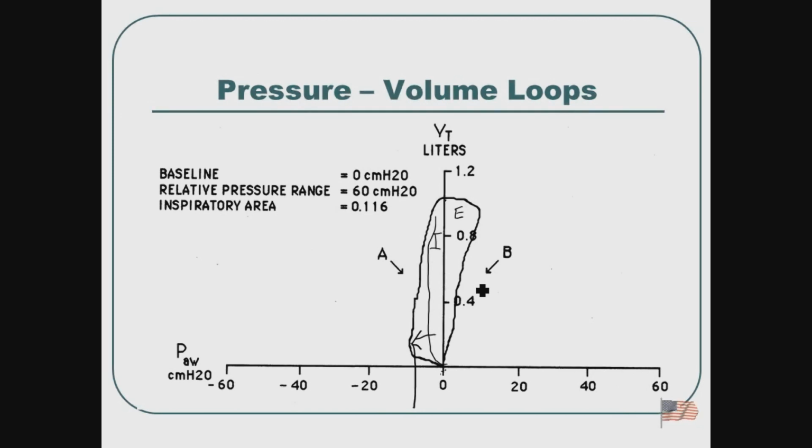So if they were going more negative, to the left? Yes. Yeah, okay. That means they're drawing more. Does that mean it is an indication they have auto PEEP? Could be something, well, let me rephrase that. They're probably not auto PEEP on a spontaneously breathing patient. Auto PEEP is specifically with mechanically ventilated patients. But this might be something where you're seeing a big negative drawback.